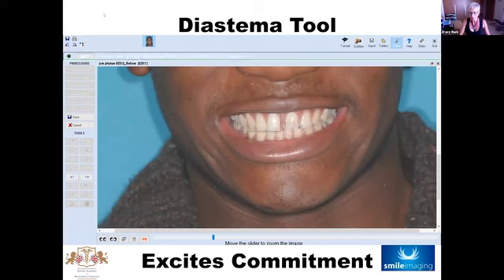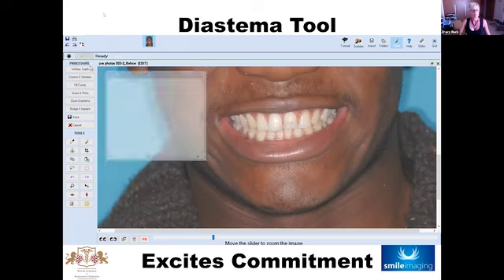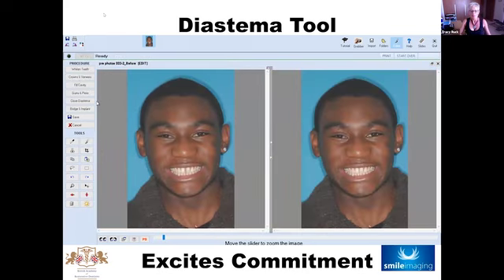So we've gone around the teeth on one side, and we're doing exactly the same thing again there on the other side. Up to next, and the 2 boxes have appeared again, or as I say, you can pull them completely together or just partially if you weren't confident that you could fully close it there. Okay, and then you've got a beautiful case to present to your patient.